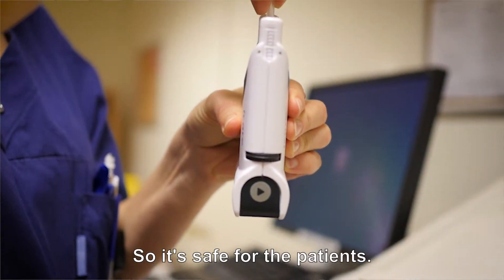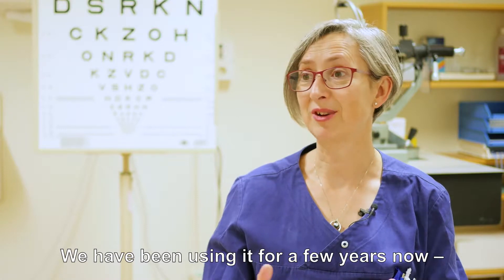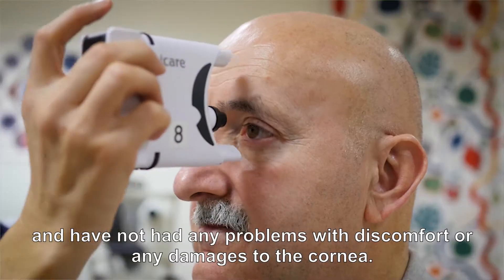It's safe for the patients, and we've been using it for a few years now and we haven't had any problems with discomfort or any damage to the cornea.